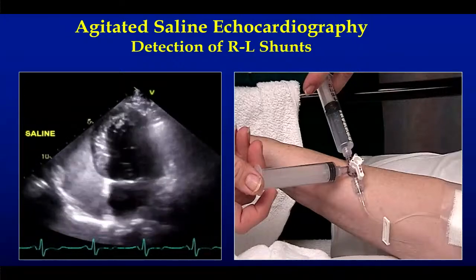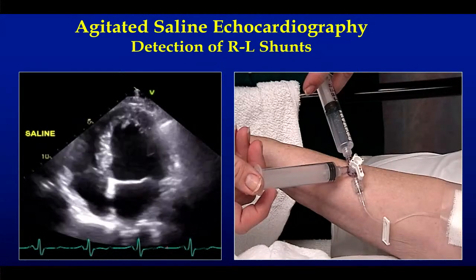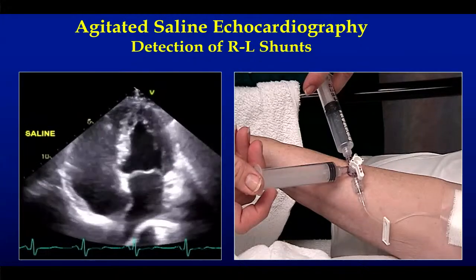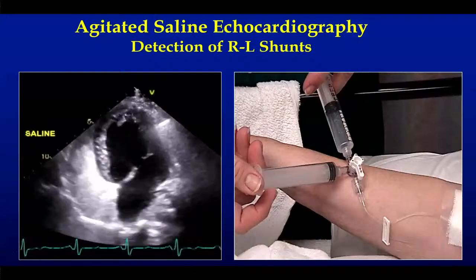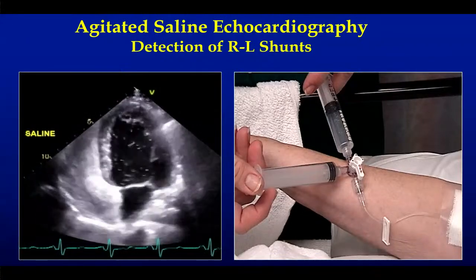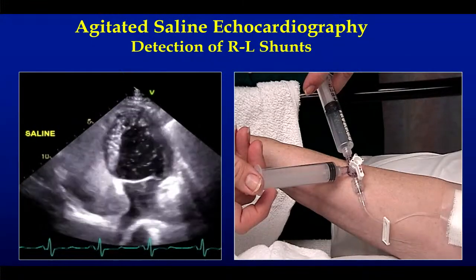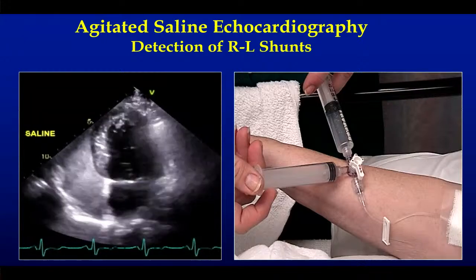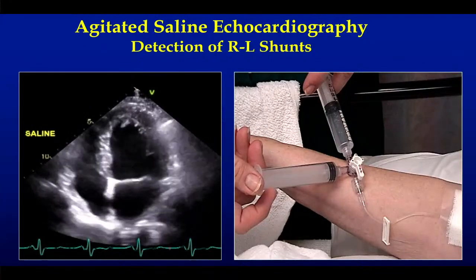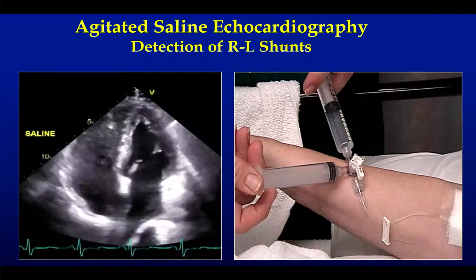You could have that in atrial septal defect. And remember, for you to be able to detect that, it's a transient higher pressure between the right atrium and left atrium that causes it. So usually it's transient, as opposed to the AV fistulas that occur in the pulmonary circulation. They're not dependent on pressure gradients, so they will take time, 5 to 6, 7 cardiac cycles, to cross the pulmonary circulation and go to the left side for you to be able to see them.